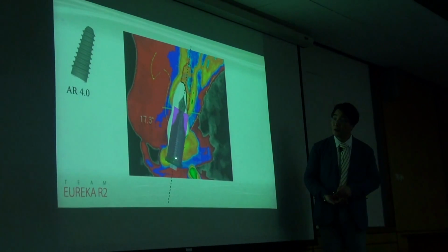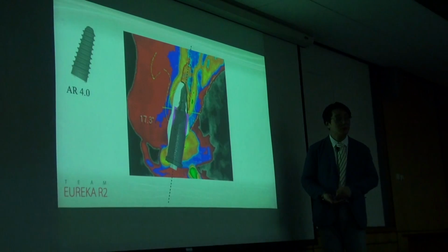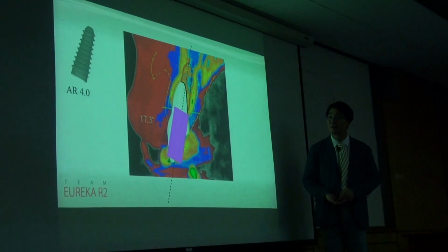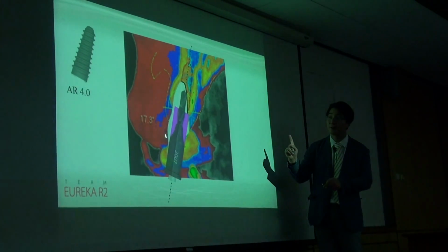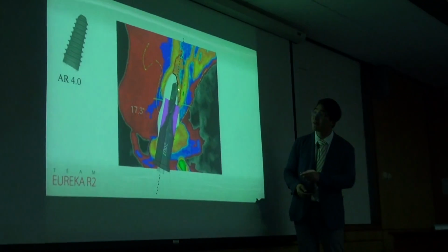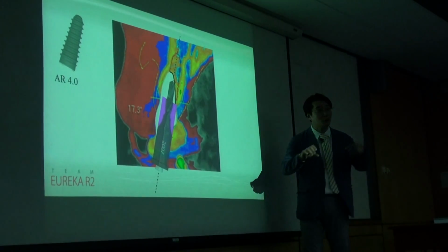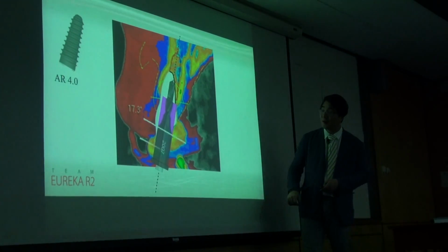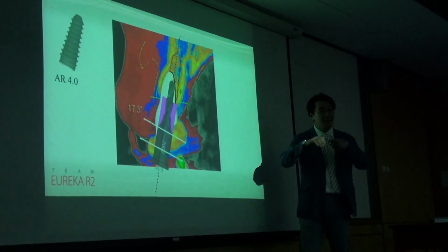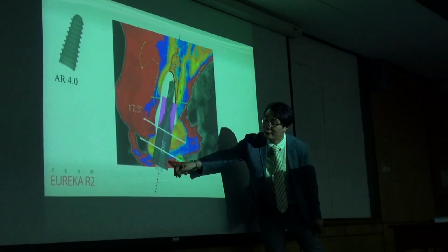And when you're using the initial drill, there is no bone touch. So skip this drill. Second drill, there is no bone touch. So skip. So we have to find the first drill in this condition. The most important thing is the drill tip is touching the bone and the drill guide part has to engage into the guide, right? So this amount of the drill is engaged in the guide, and I have some space for the drilling.